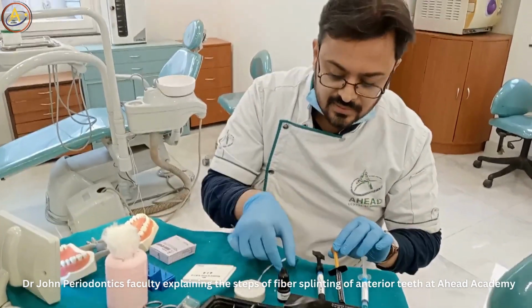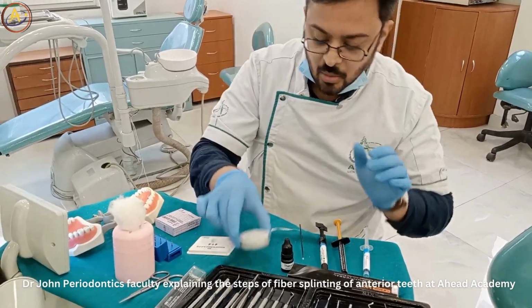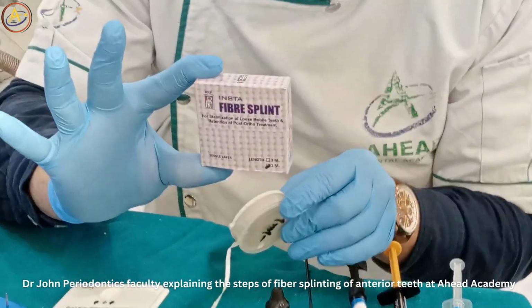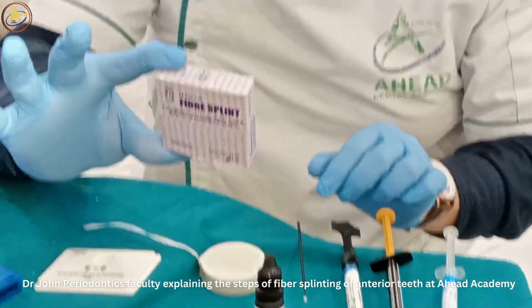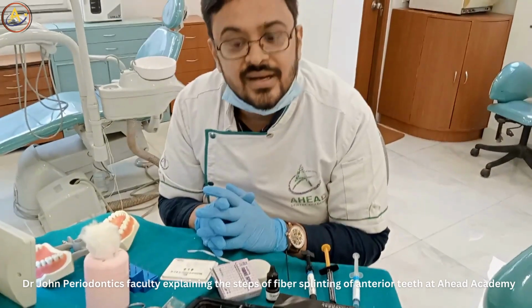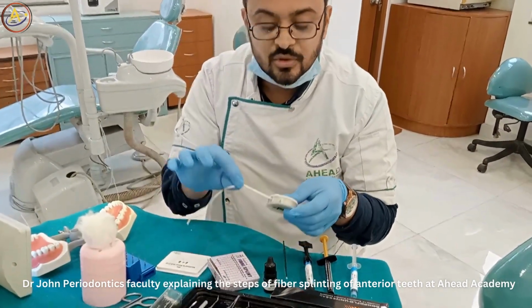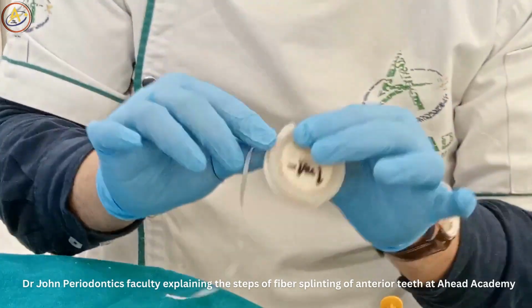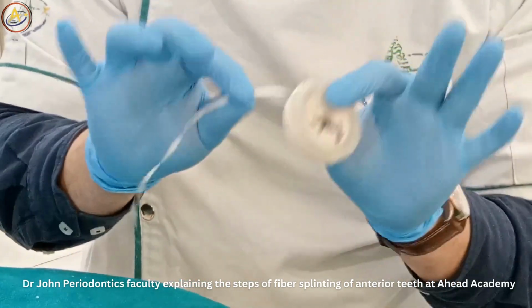Okay. This is your applicator. Now what is this? This is the fiber splint. Okay, the fiber, it's also called the rebond material. You sometimes do splinting with a thread that is called a fiber. It gives you strength when you apply it between the teeth and the composite. It is not used every time, but it is used in some cases of splinting.